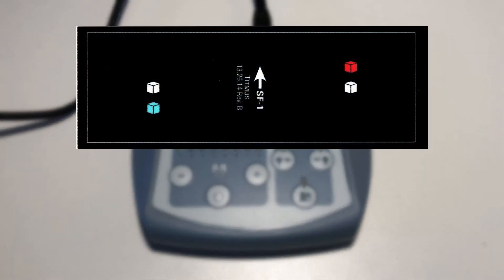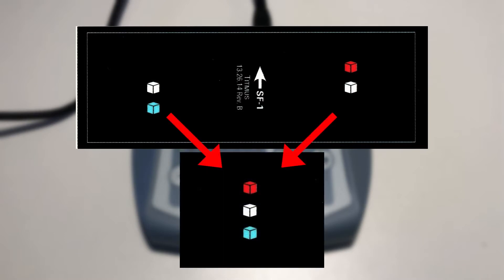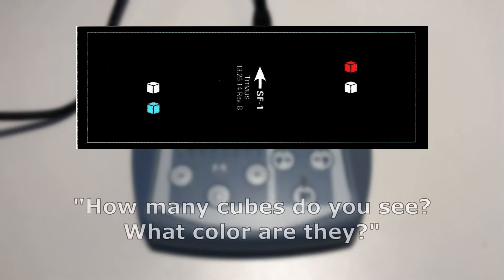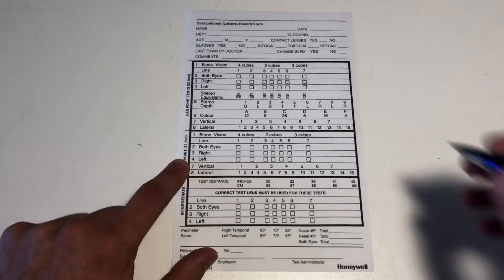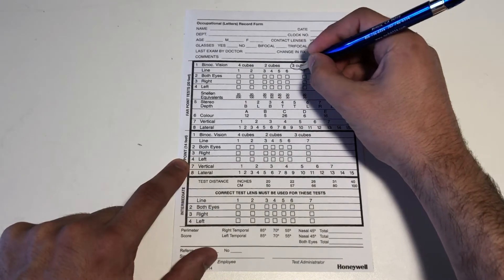The first slide is testing the patient's binocular vision. When their eyes adjust, the patient should see a combined image that looks like this. Ask the patient, how many cubes do you see and what color are they? In order to pass, the patient should see three cubes: a red one on top, a white one in the middle, and a blue one on the bottom. Record the results by circling the number of cubes seen by the patient.